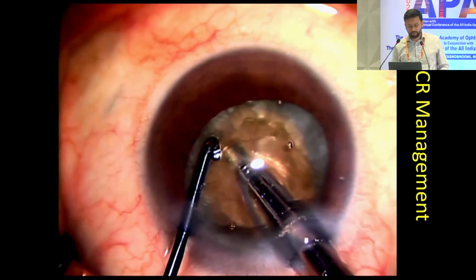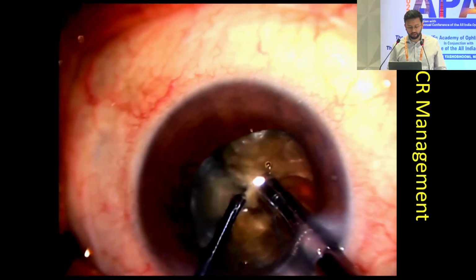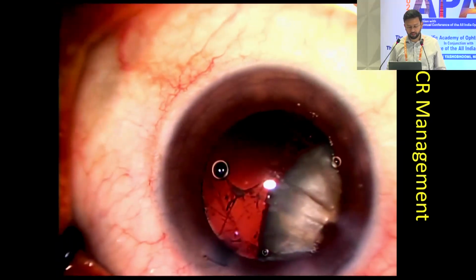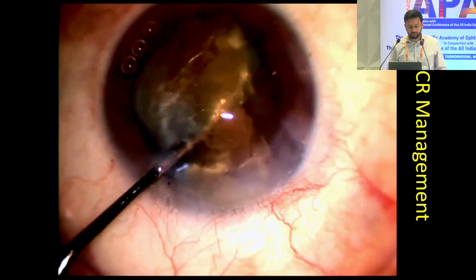So all the time we cannot have such positive results. This was a very hard cataract, and while attempting chopping of the nucleus, we realized that there was a pre-existing PCR, or this PCR was created during hydrodissection, and the nucleus was almost slipping down into the vitreous.